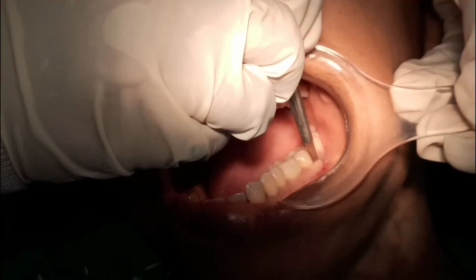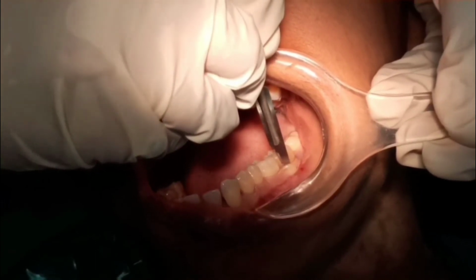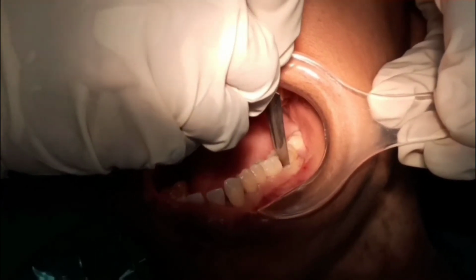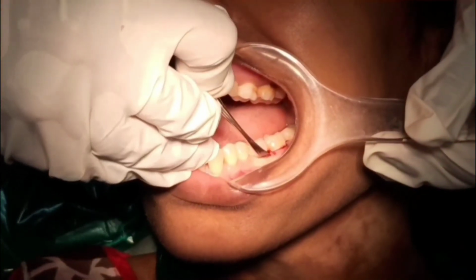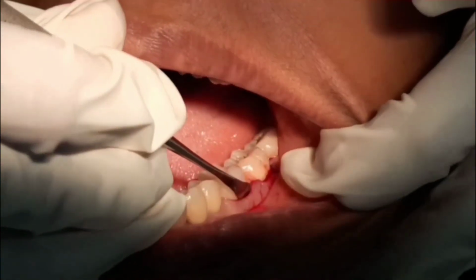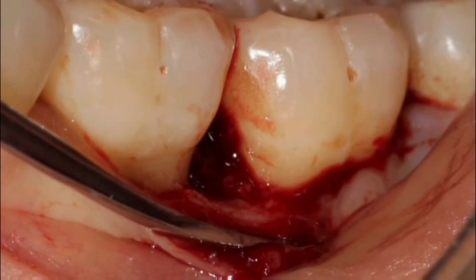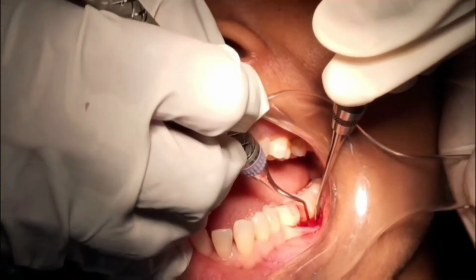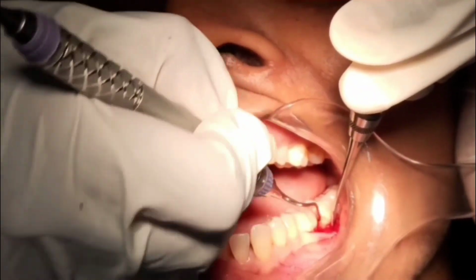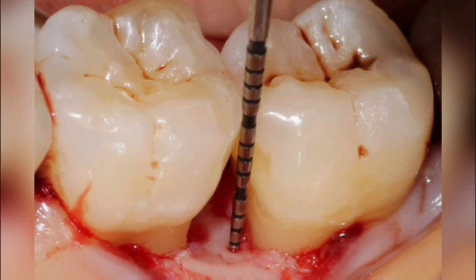A crevicular incision is given by using a number 15 blade. The blade was directed from the gingival sulcus towards the alveolar bone crest. A full thickness mucoperiosteal flap is reflected by using a periosteal elevator, and thorough debridement of granulation tissue was done using curettes, and residual calculus deposits were removed using a scaler. The depth of the defect was measured, which revealed that it was a shallow two-walled defect.